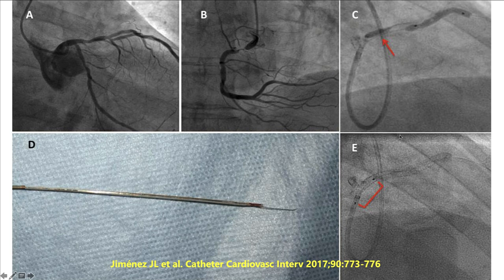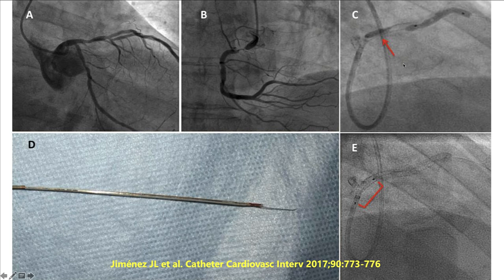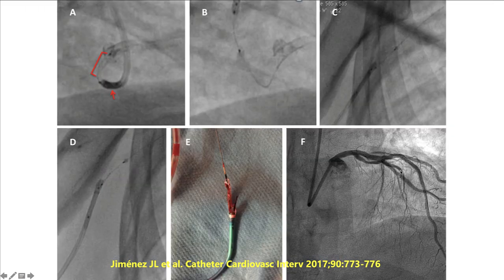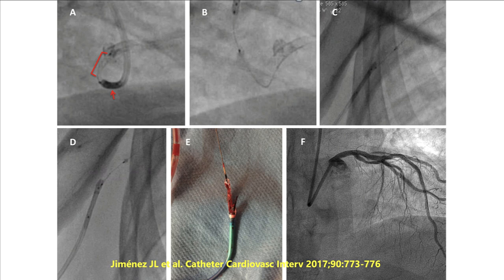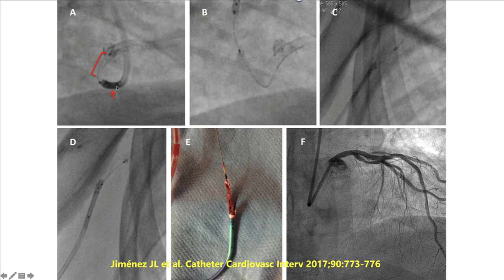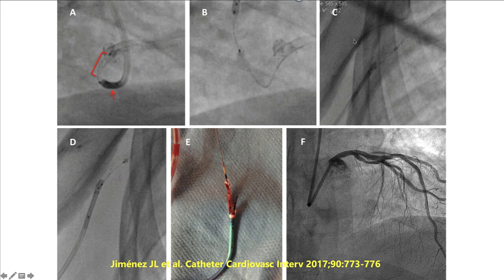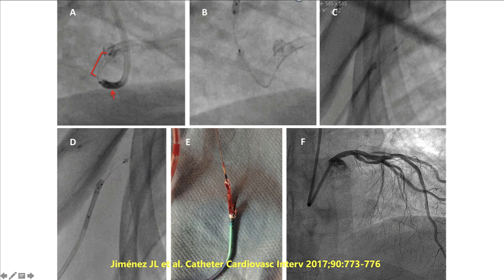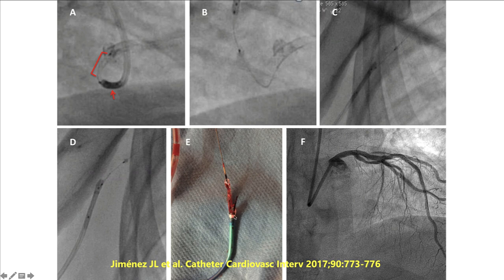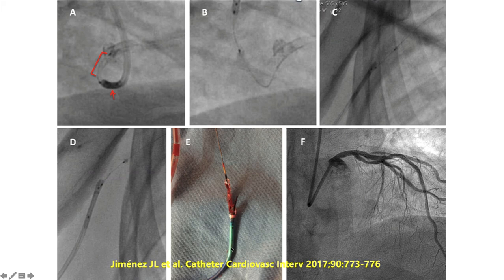Here is an example: a patient underwent PCI of a right coronary and LAD lesion, with an unfortunate fracture of the balloon shaft leaving part of the balloon in the coronary vessel. The operators confirmed enough balloon segment remained inside the guide catheter, advanced a second balloon to the tip of the guide catheter while keeping it inside, inflated it, and pulled everything back successfully. This shows how the entrapped balloon and the trapping balloon came out together, enabling retrieval of the equipment.